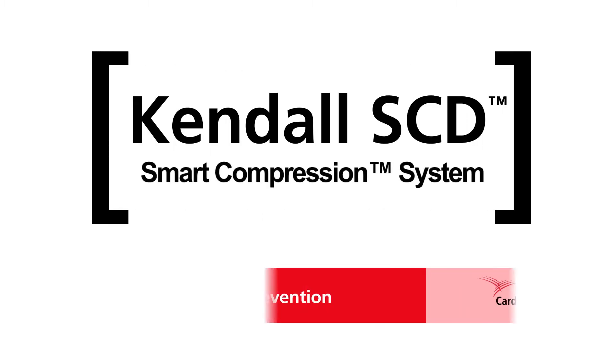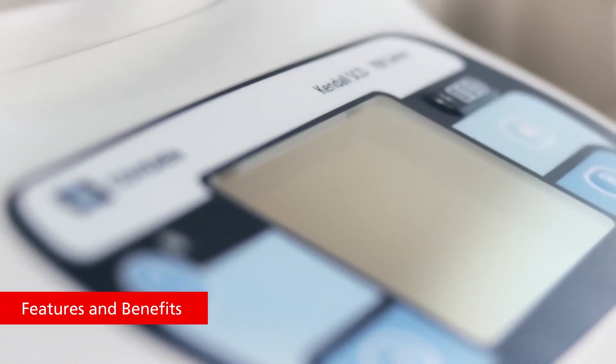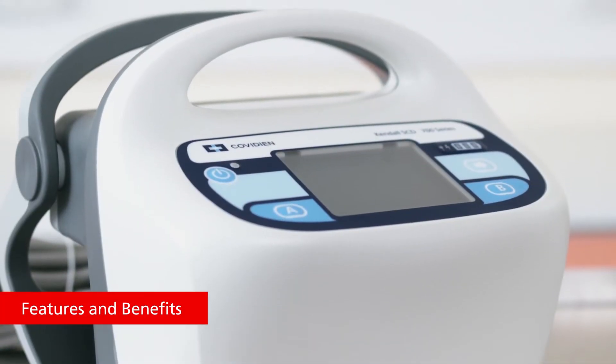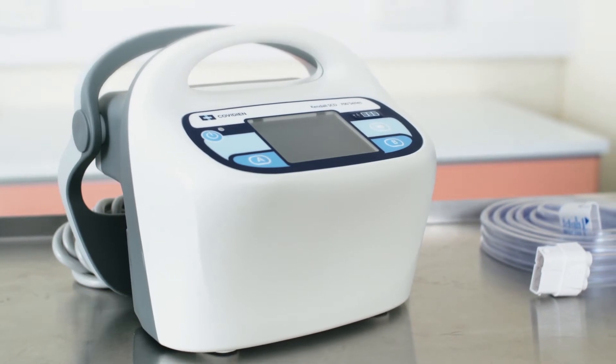Kendall SCD Smart Compression System, your partner in VTE prevention. The Kendall SCD 700 Series controller is a compact, lightweight, easy-to-use, all-in-one controller designed to address functionality and provide convenience.